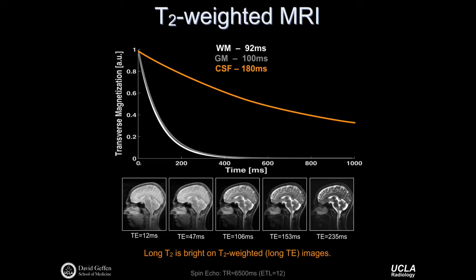Well, after the saturation pulse is played, we can wait different amounts of time, allowing the magnetization to develop image contrast, if you will, and the image contrast will look fundamentally different at each of these time points because of these different relaxation properties for different tissue types. And so if we go out to intermediate times, we're waiting now 100 milliseconds after that saturation pulse has been played, we can see more distinct white matter, gray matter contrast. And in fact, we can see that the CSF signal stays quite bright.